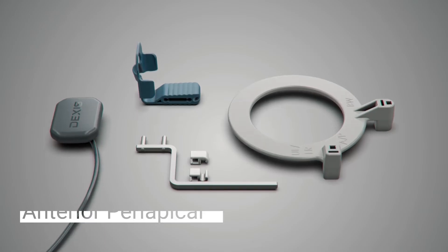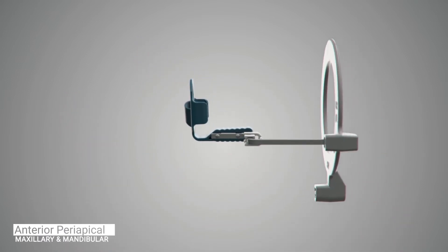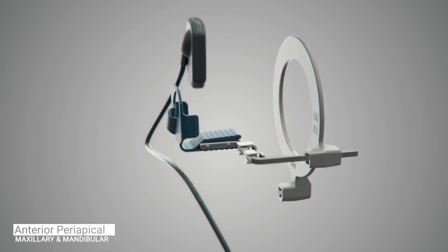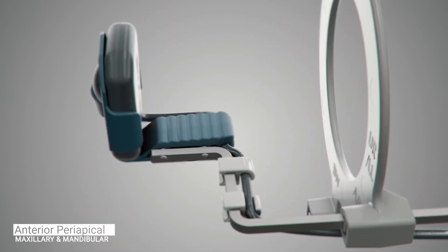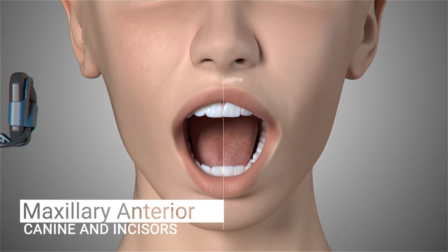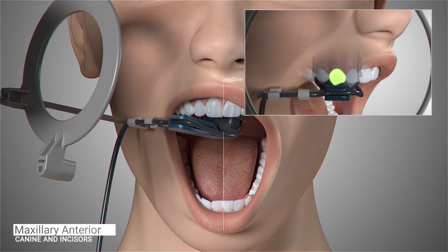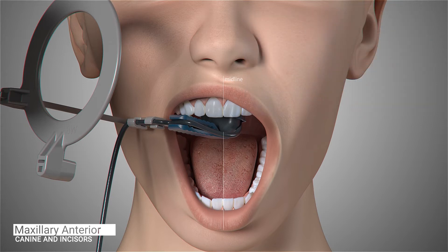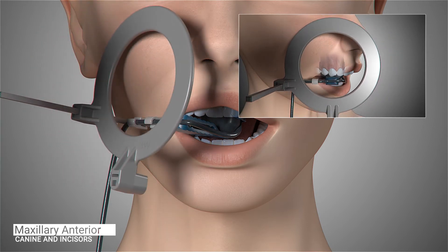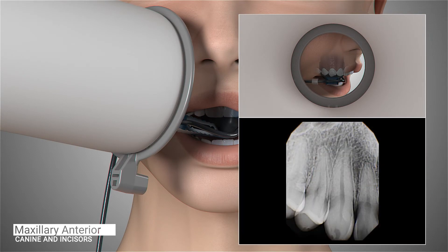We will now move on to capture anterior periapical images. For anterior periapical images, you will use the same aiming bar and ring configuration. However, you will switch the yellow posterior bite block to the blue anterior bite block. Begin by taking the maxillary right canine. Position the sensor so the canine is centered on the sensor, well into the palate and parallel to the long axis of the tooth. Ask the patient to close and slide the aiming ring as close to the patient's face as possible. The cone of the x-ray emitter must be placed flush with the aiming ring and then trigger the exposure.